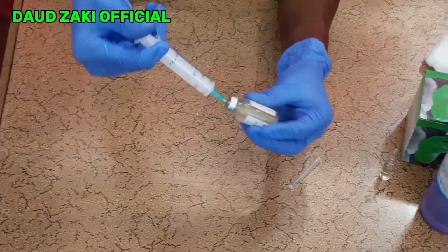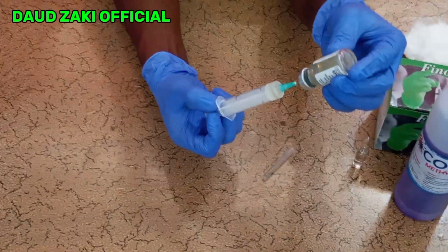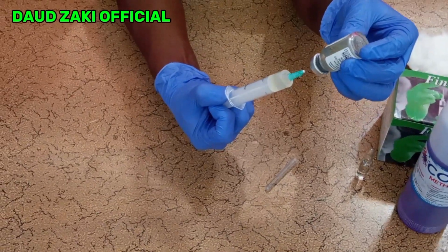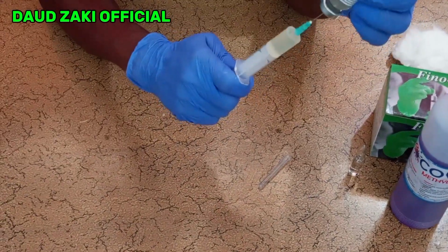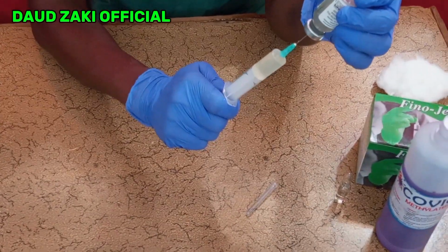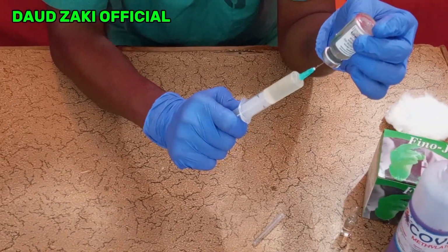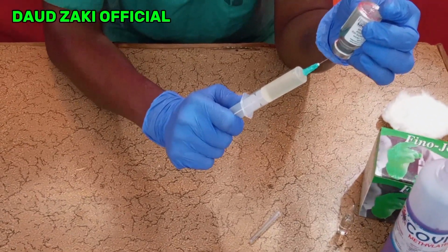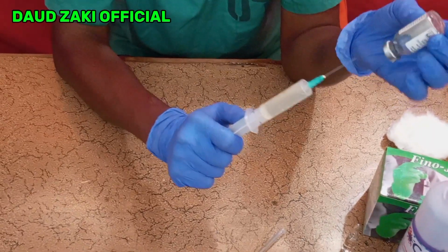Then you hold the vial upside down for you to withdraw the medication safely. So this is how you are going to withdraw. Ensure that the tip of the needle is within the liquid of the drug, not outside, to avoid air bubbles rushing into the syringe. So this is how you withdraw the drug.